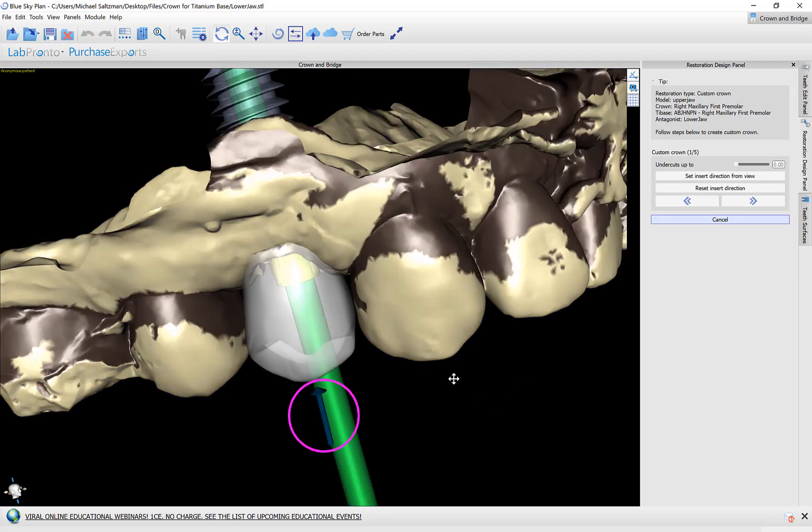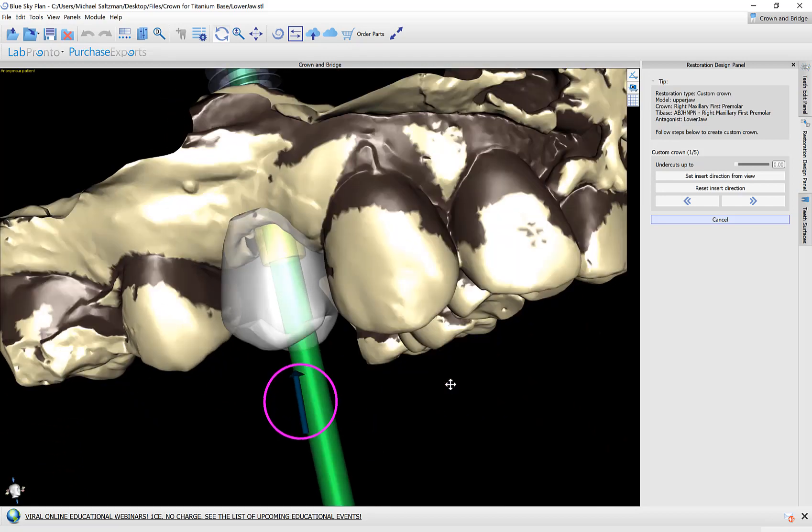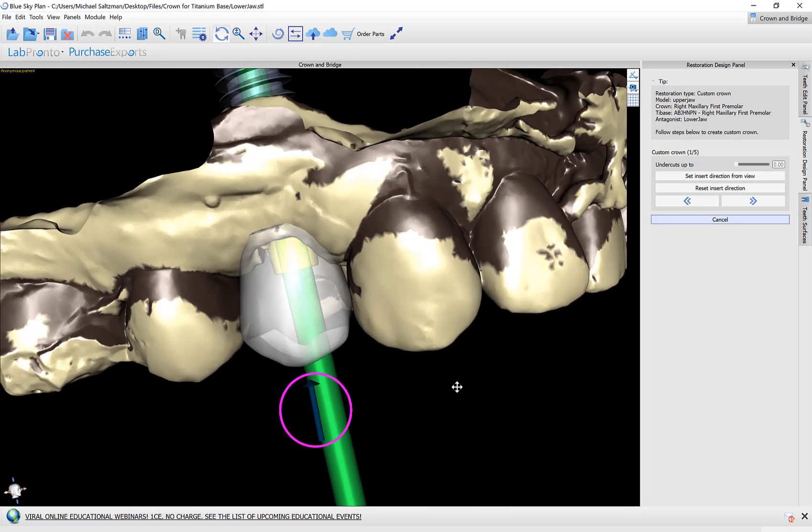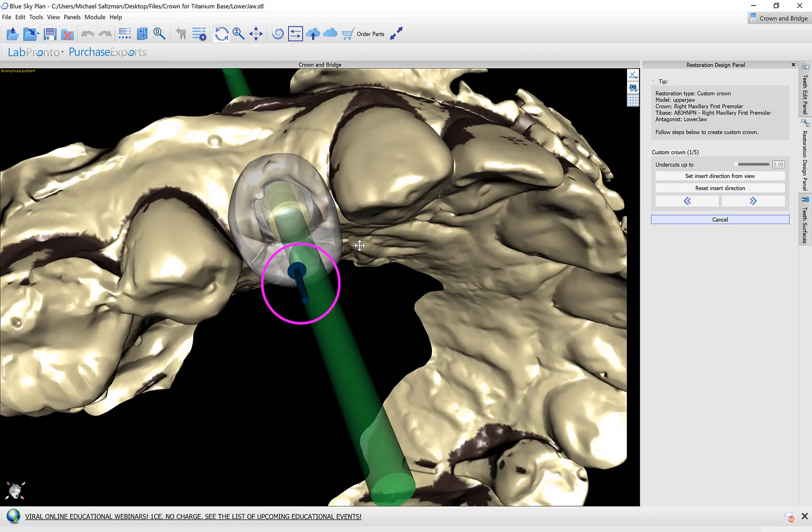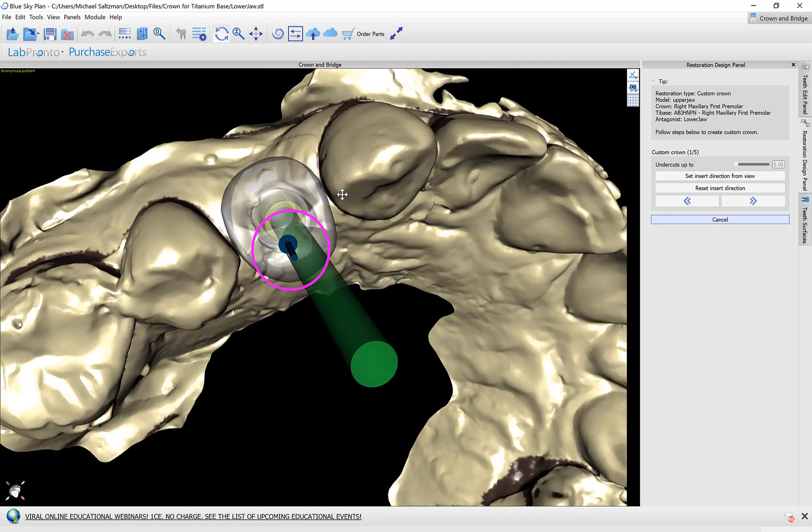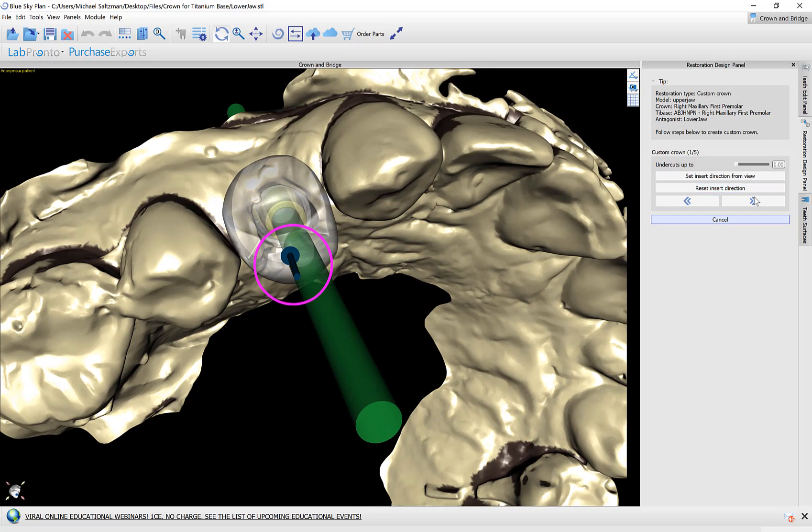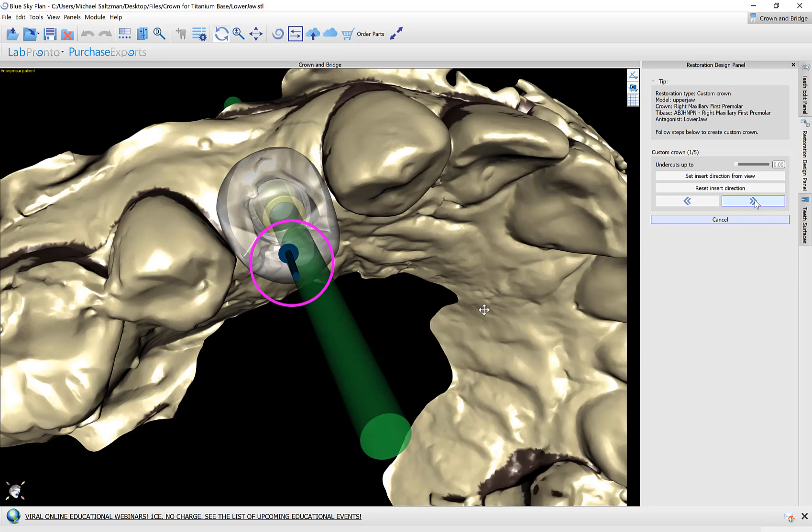The first step in the process is the undercuts. You can modify the undercuts by using the widget around the arrow or by properly orienting the model and then clicking set insertion direction from view. We have a slider if you would like to allow some undercuts. Now I'm going to click next.